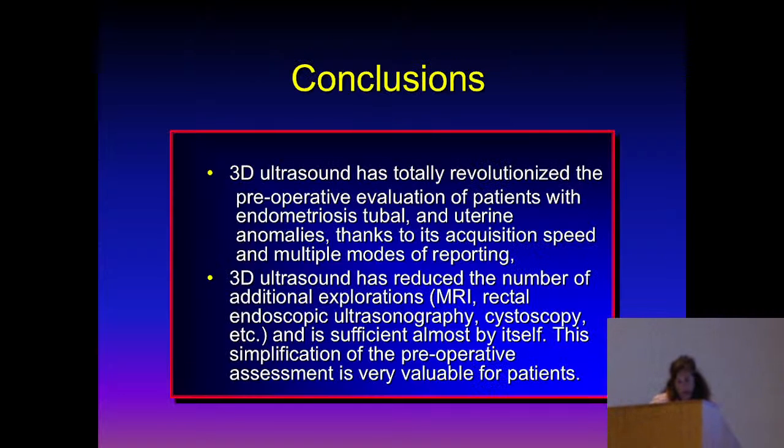Okay, so in conclusion, the 3D ultrasound has revolutionized pre-op evaluation of patients. It's important for the surgeon to do their own. You could do the pain mapping. You could pick up things that a report may not be able to. If you have an ultrasonographer do the mapping for fibroids, you want to know the exact location of every fibroid, the size, and the type it is, and they should characterize based on the FIGO staging.